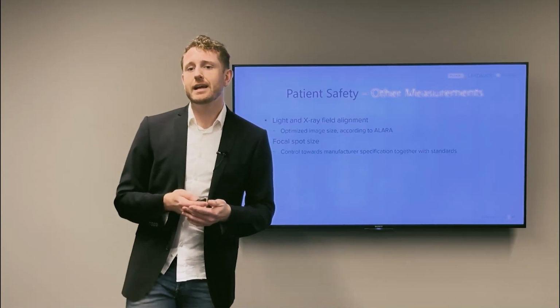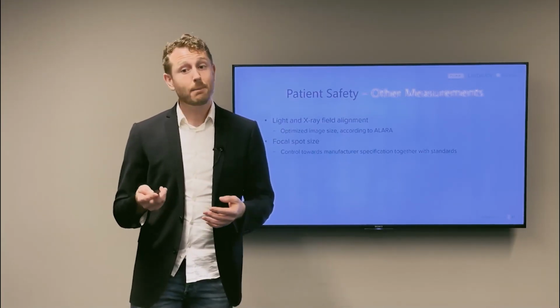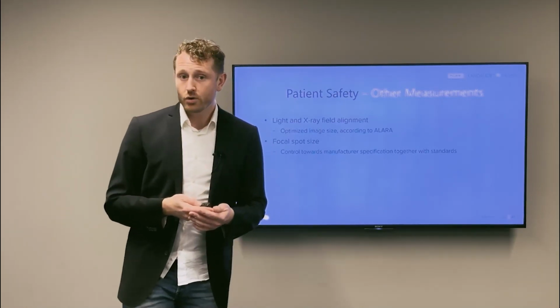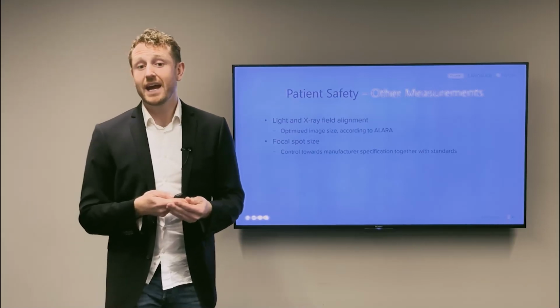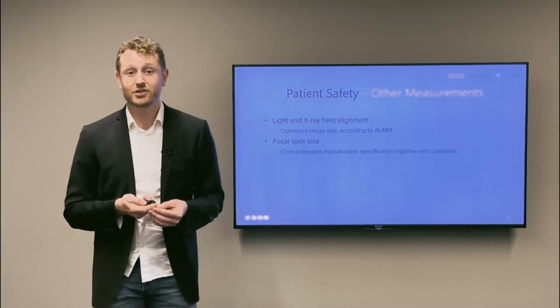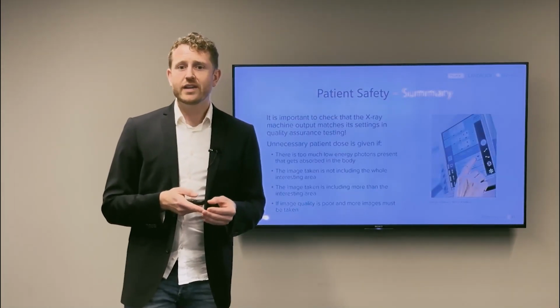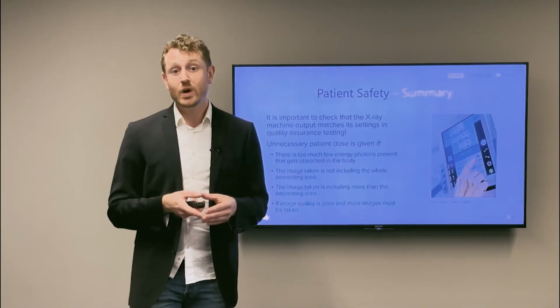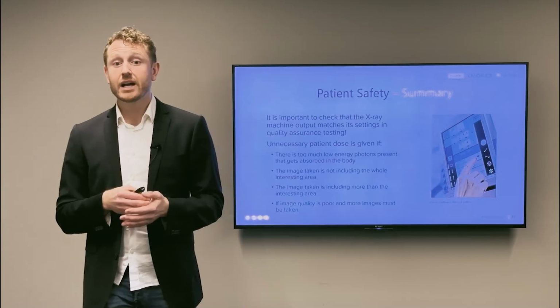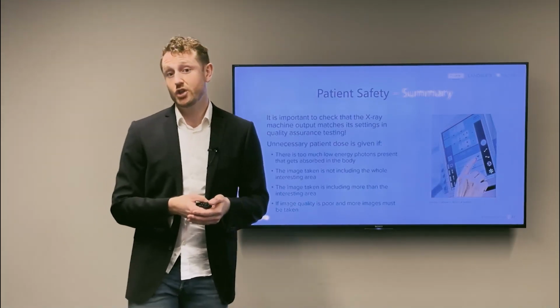both affecting patient safety. If the picture taken is too large, the patient has received unnecessary dose. Focal spot measurement can also be made to see if it matches the size given by the manufacturer. Making sure that the X-ray machine output is well known and consistent is of great importance if one would like to make good quality images together with minimum patient dose.